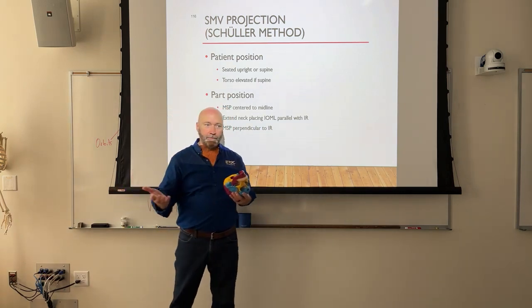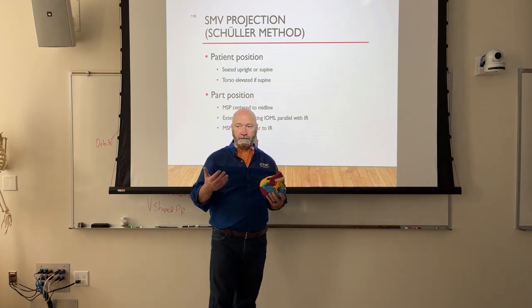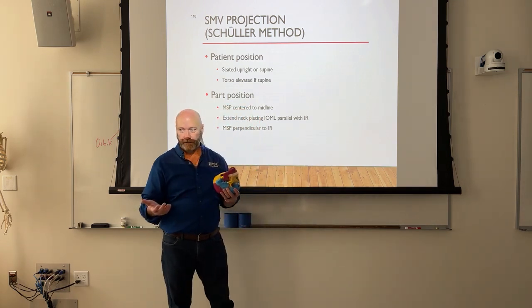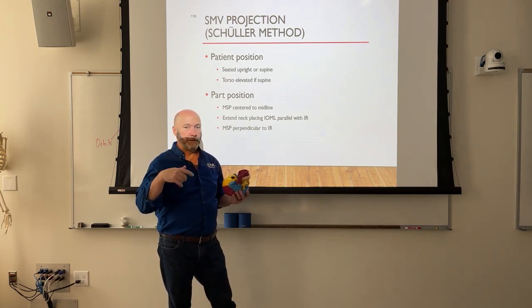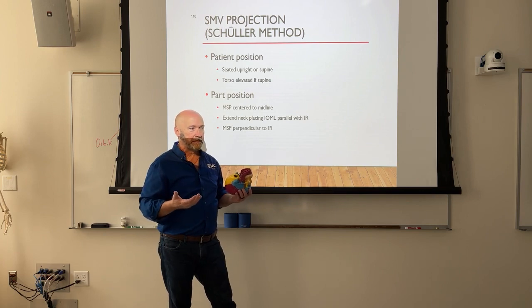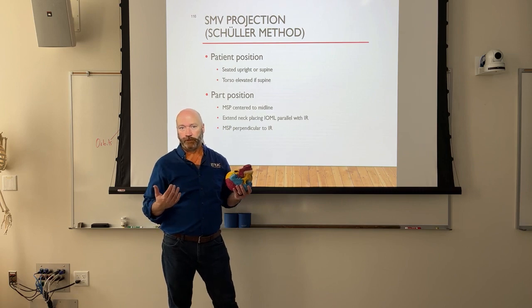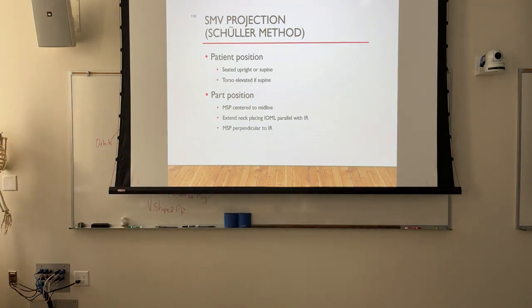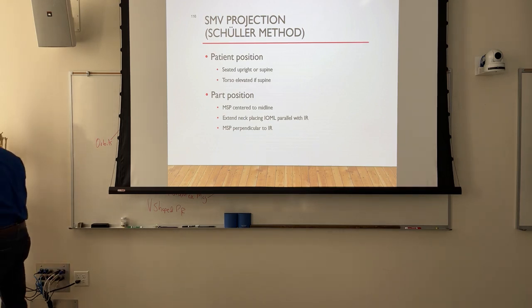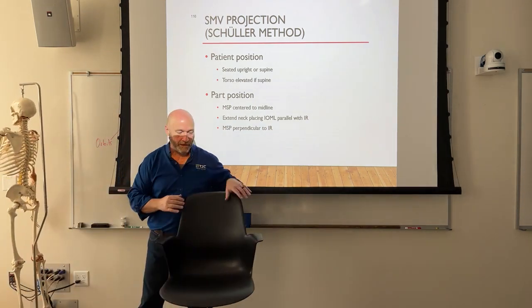Your other option is to have the patient, granted, this assumes the patient isn't in the hospital because they fell and hit their head, right? If the patient can assume the position, let's say you're doing sinuses, it's easier to do with the patient in a chair, and I don't mean a stool, right? I mean a chair with a back, and it could be a back with wheels on it. Just picture this happening. It's funny in concept. It would be tragic in reality.